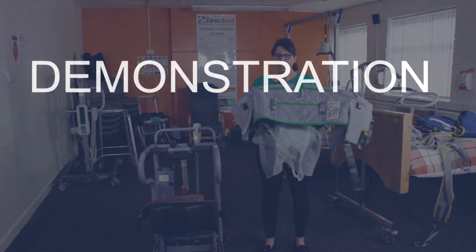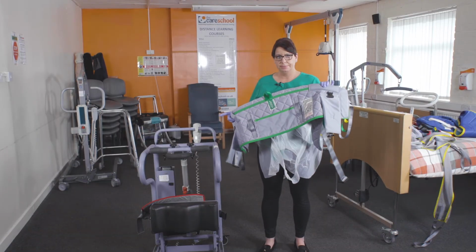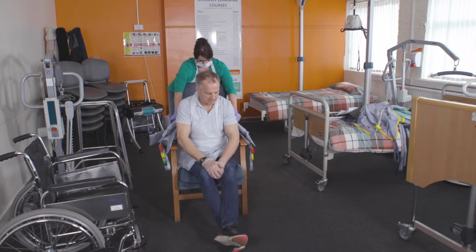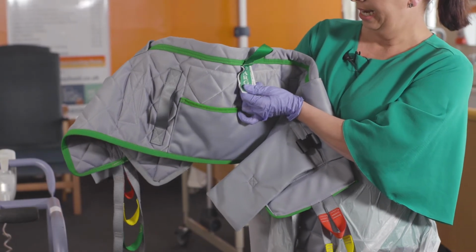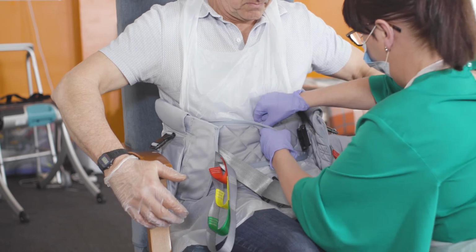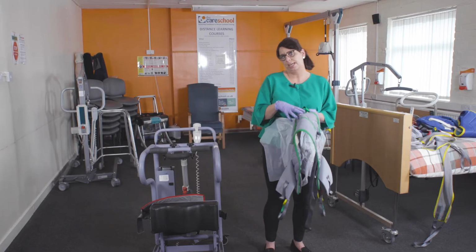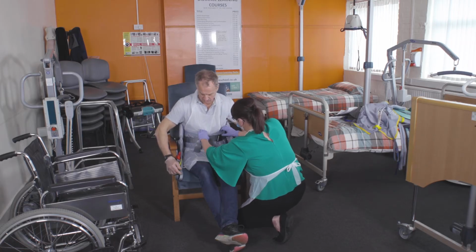So this is a sling that we'll be using with the standing aid. When you apply the sling around the service user's waist, always make sure the label is at the back. This would fit around the service user's waist. And also it's important to check the size of the sling as well, but this should be detailed in the person's care plan.